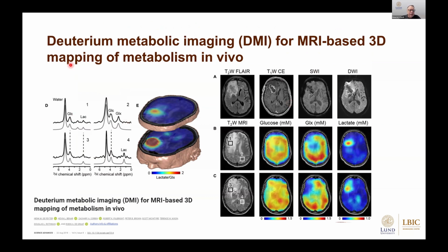You see on the left here these spectra, you see a bit of water signal because, as I showed, not 100% of the water is 1H. There's a natural background of this 0.015. The glucose is close to that. That's the one that's injected. And you can see that either lactate is produced or glutamate.